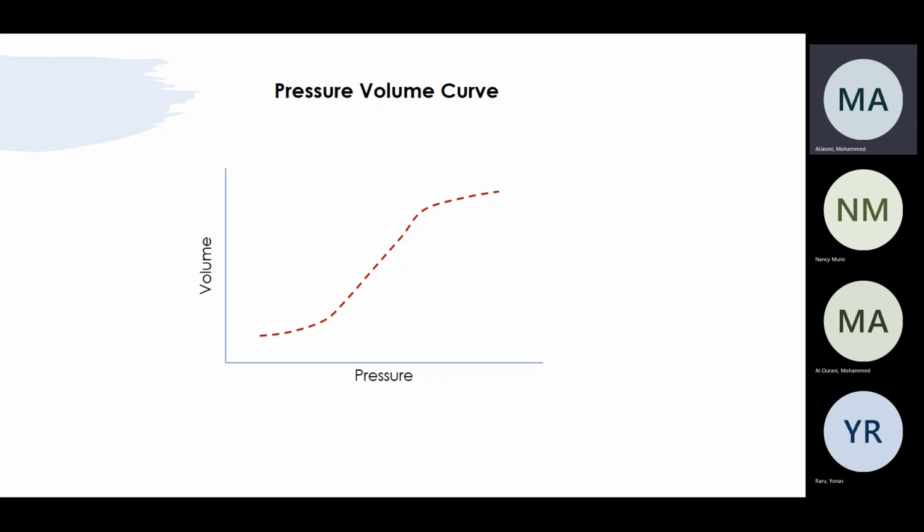Is that right? It's very important to see whether the patient has good compliance or not: poor compliance, high compliance, low compliance, and whether the patient has high driving pressure or not. We'll talk about that more. If I'm not giving a good PEEP, as Kareem said, it's not the number that meets the physiological PEEP the patient requires in this disease, because he's not a normal patient, is that right? The patient has a disease in his lung.